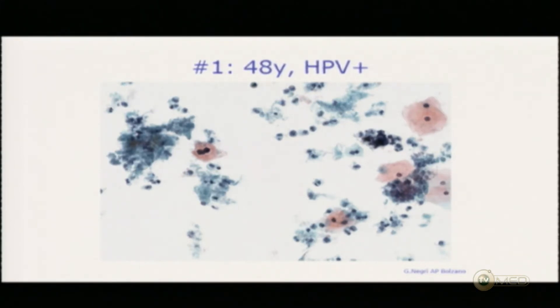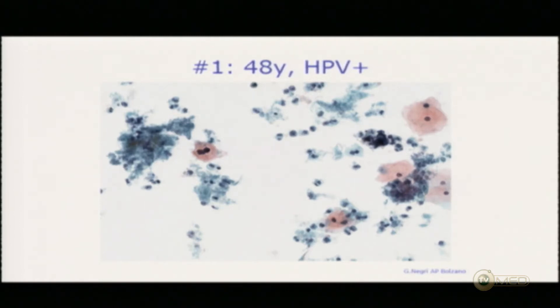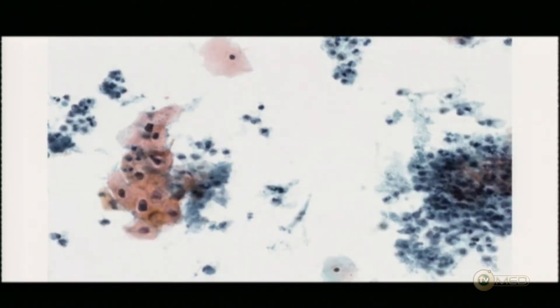It's a clear case with larger cells and at least one cell with dark nuclear — dark and abnormal — and it's a binucleation. So everything is clear. Then if you look at other parts of the smear, you find that again something is not really normal.